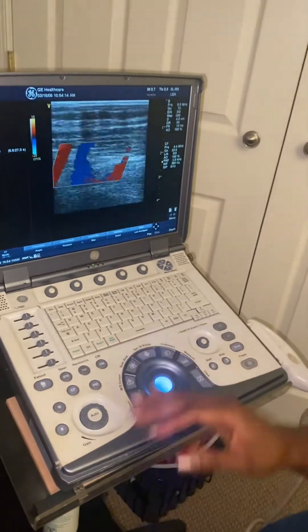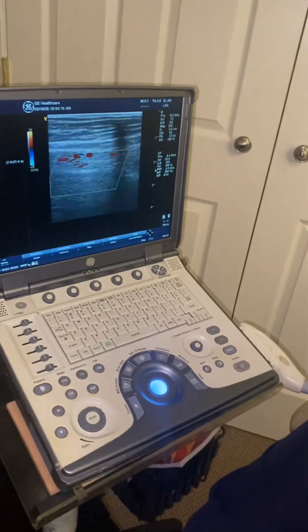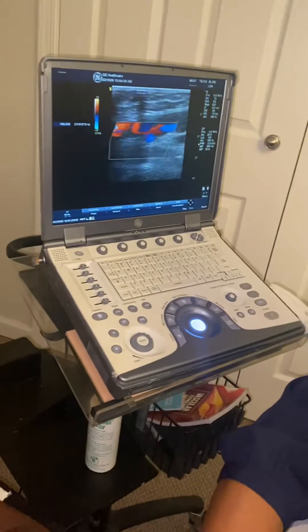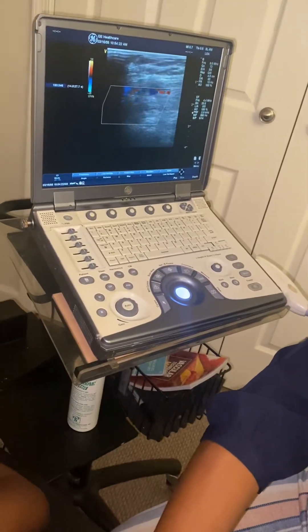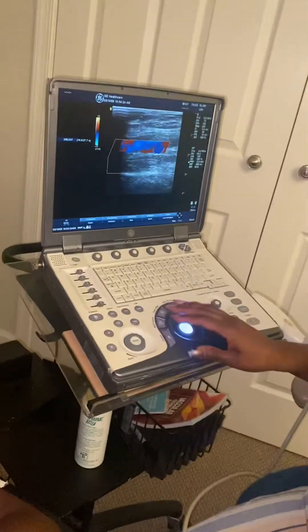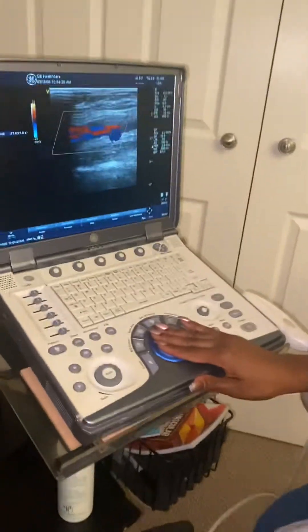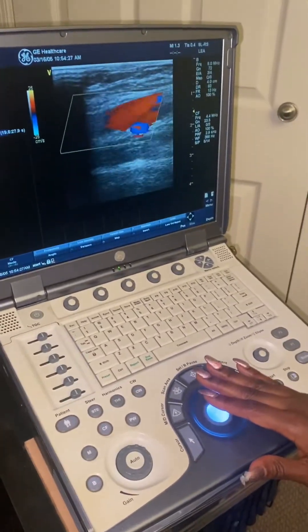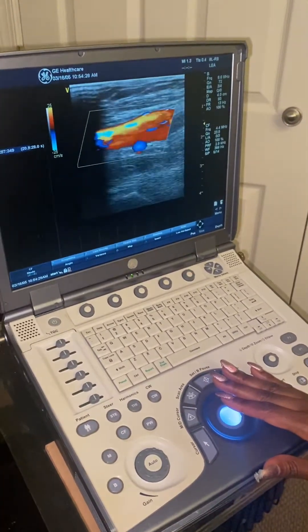I'm going to start right at the groin. As you go all the way to the groin, you're right at the common femoral. After the common femoral, I usually would just wrap my probe up as high as I can to get the distal segment of the external iliac artery. And as you come down, you're in your common femoral artery.